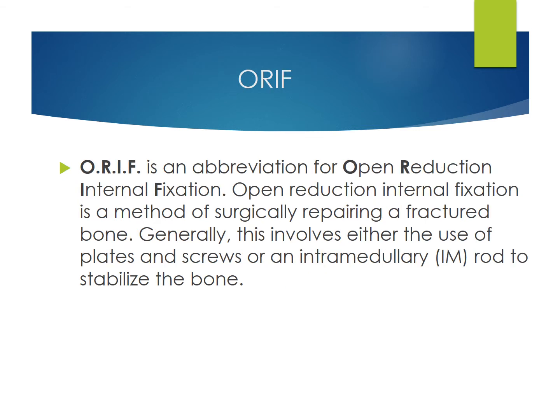ORIF. ORIF is an abbreviation for Open Reduction Internal Fixation. Open reduction internal fixation is a method of surgically repairing a fractured bone. Generally, this involves the use of plates and/or screws or an intramedullary rod to stabilize the bone.